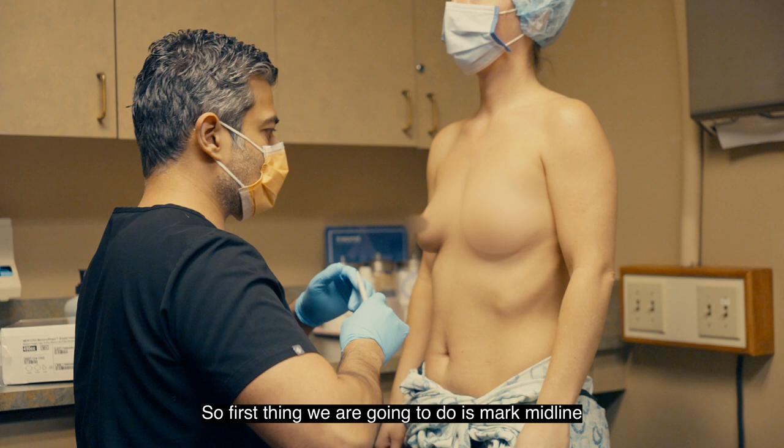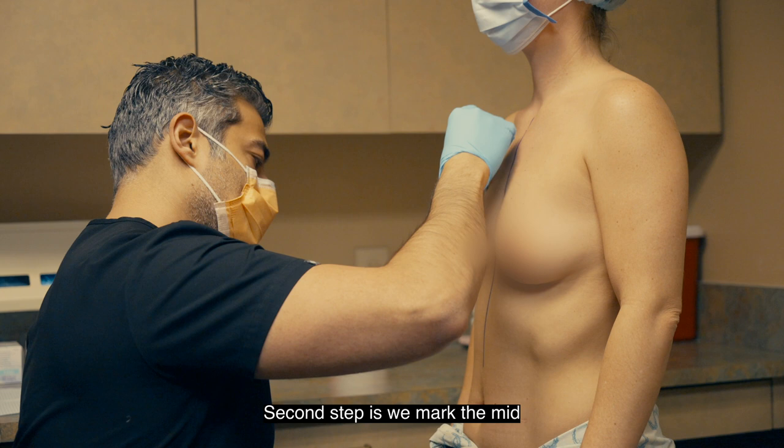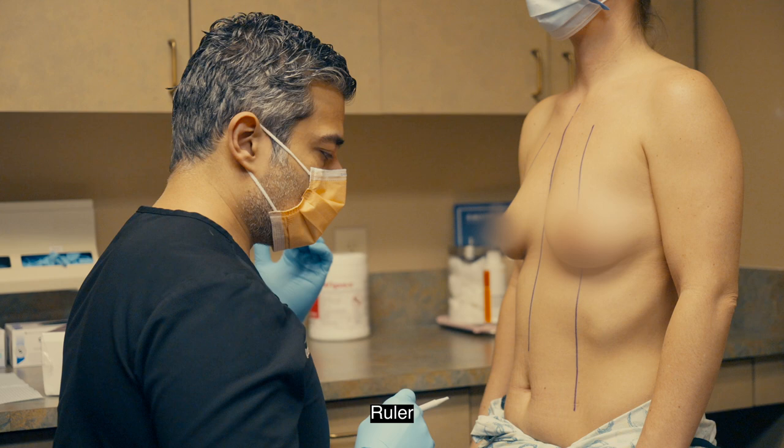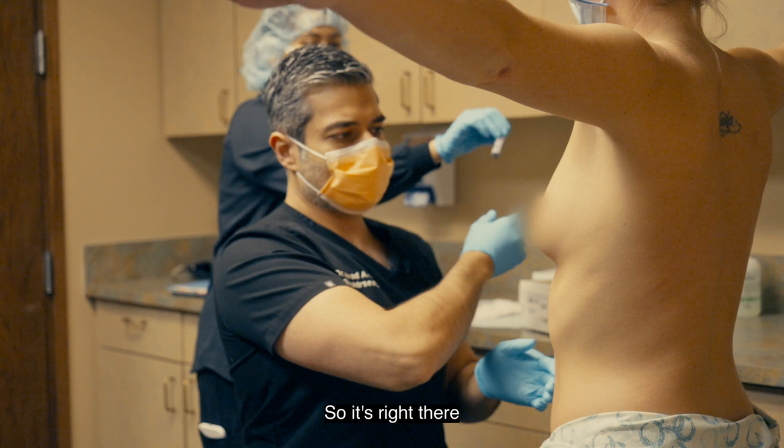The first thing we're going to do is mark midline. I feel for what's called the sternal notch and we're going to go all the way down. The second step is we're going to mark the mid breast line on both sides. The third step is we're going to mark your existing anatomy. We're going to mark the new nipple.